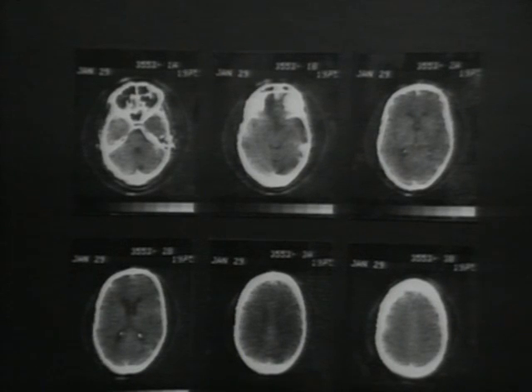Tissue abnormalities may be conveniently divided into three large groups according to the density alterations they exhibit in the scan pictures. Firstly, lesions with an average density higher than that of normal tissue. Secondly, lesions with an average density lower than that of the surrounding normal tissue. And thirdly, lesions with the same density as normal tissue.